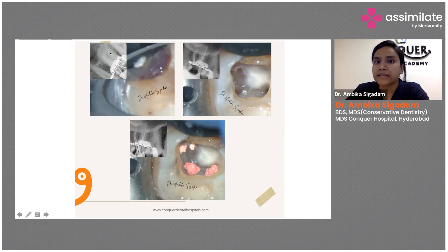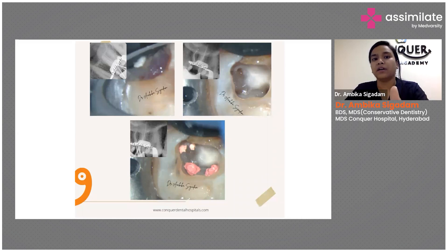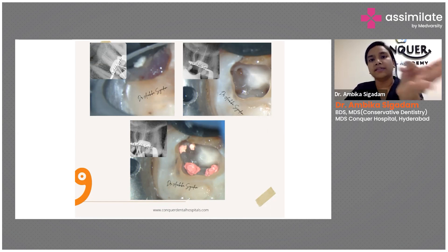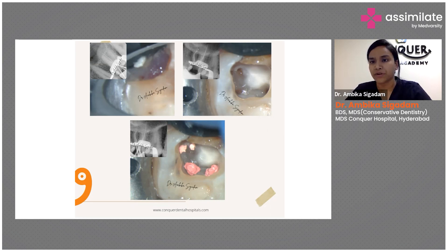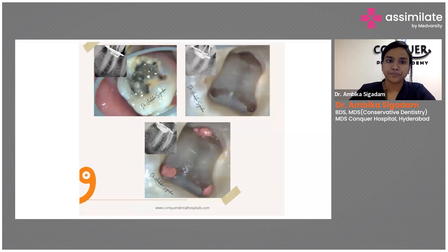Here we did the same — we went with endo only and didn't touch anything related to perio. We just proceeded with irrigating, then placed calcium hydroxide, gave a one to two week time frame, and then went ahead with obturation.